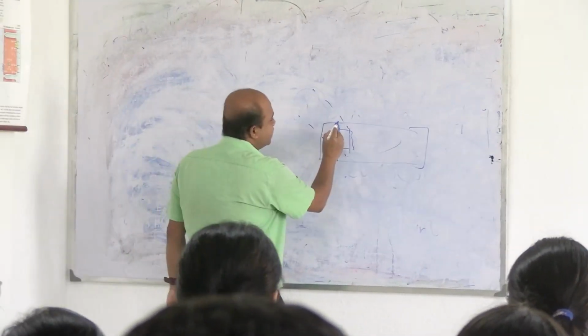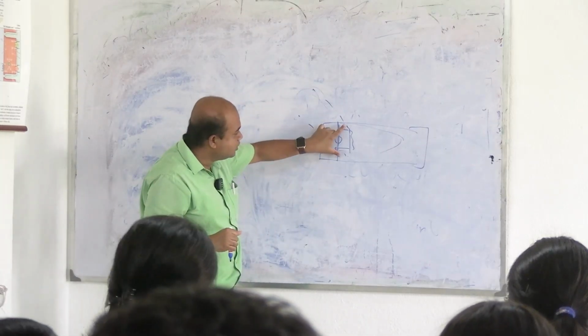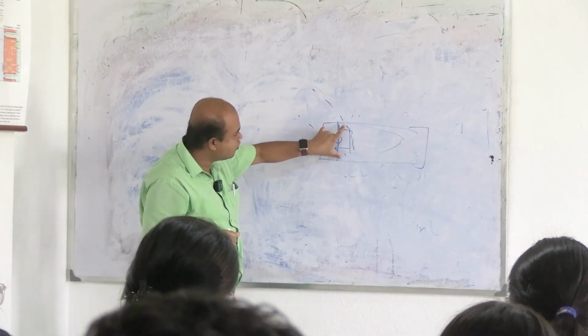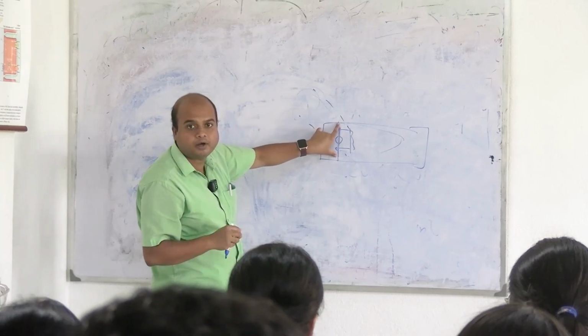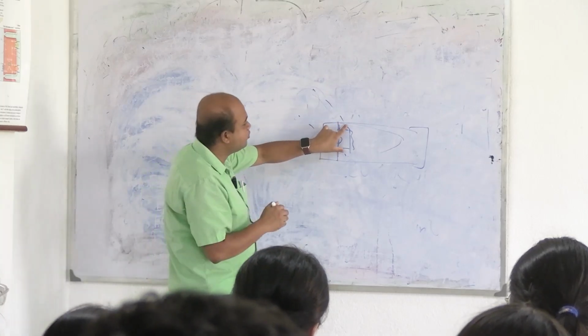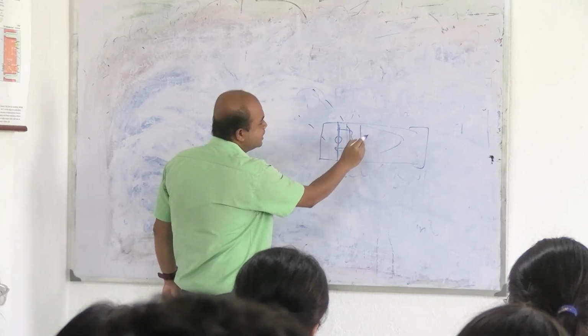Now ideally, as you draw, the blood will cover almost the whole breadth of the slide. Then it will cover somewhat less over this area, then somewhat less of the breadth.